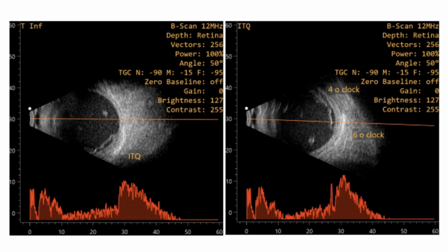On follow-up ultrasound, the vitreous cavity showed a moderate amount of low reflective dot echoes, and along with that there was a high reflective corrugated membranous echo and a few subretinal echoes as well in the inferotemporal quadrant extending from 4 to 6 o'clock. The membranous echo was persisting in the low gain, so it was suggested that there is a focal retinal detachment.